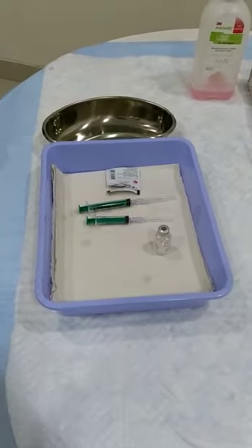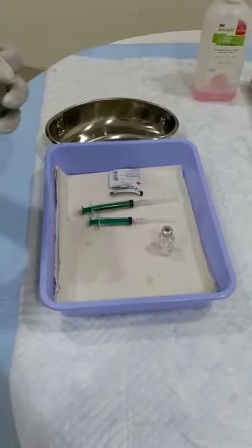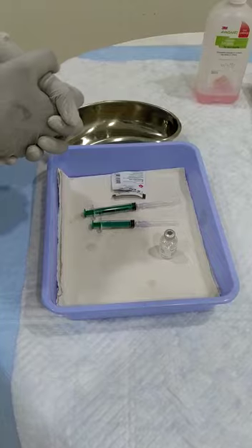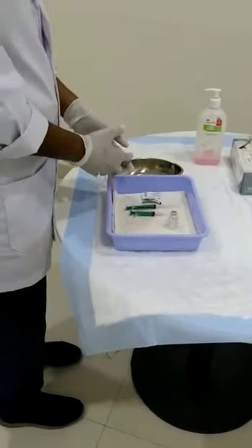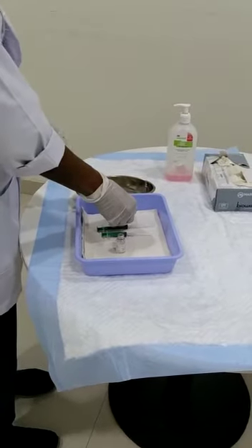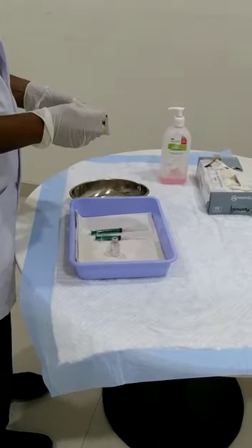Ensure we do a proper hand hygiene and wear our comfortable size of gloves. Now take the multi-dose heparin vial and swipe the lid with an alcohol swab.